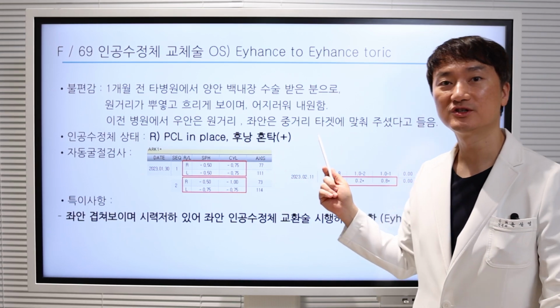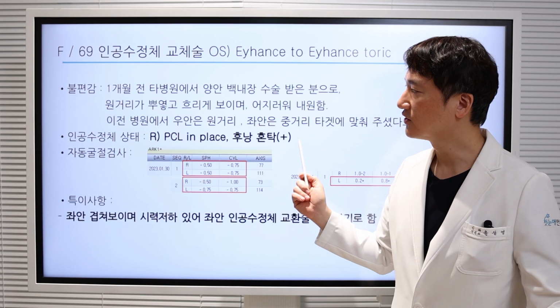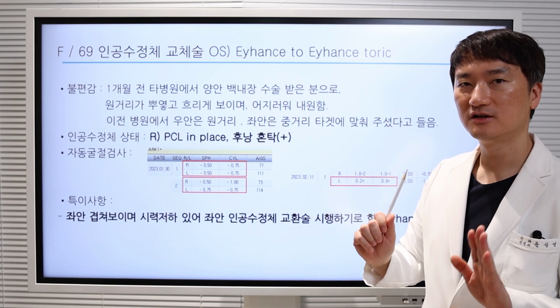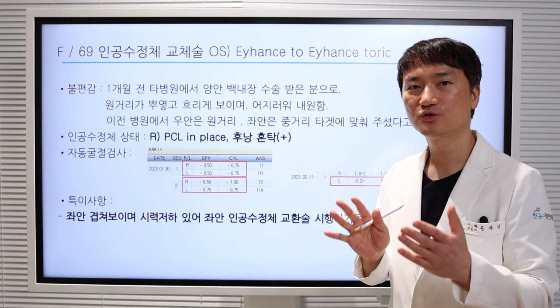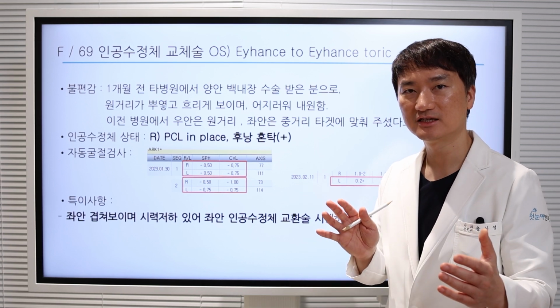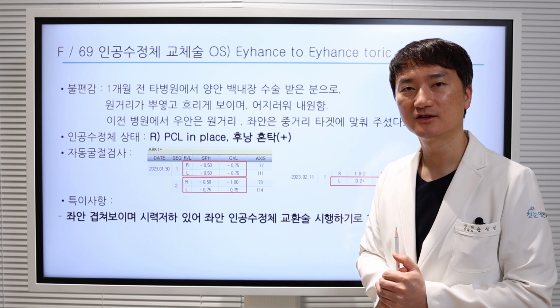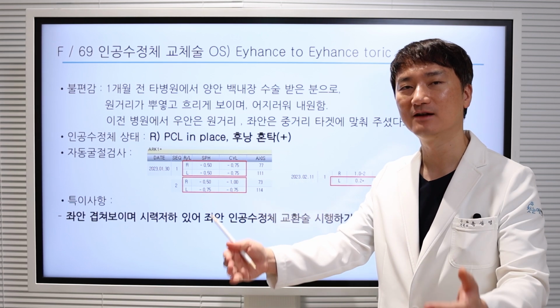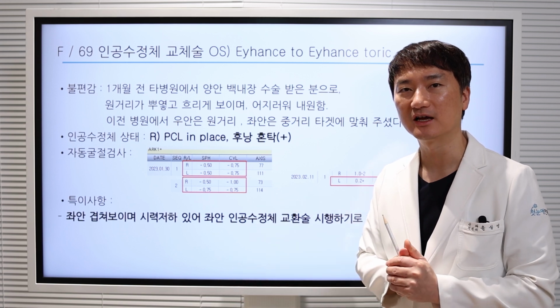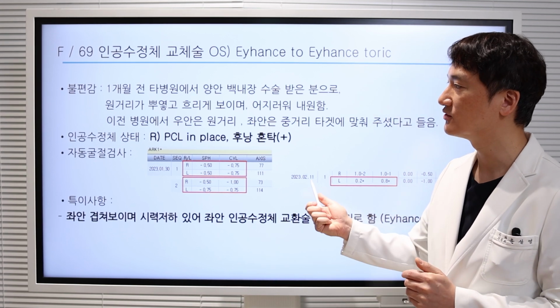They opted for monovision. In these situations, while the Eyhance lens provides a wider focal range, it does not quite reach the effectiveness of a multifocal lens. Therefore, when you adjust the Eyhance lens to achieve clear vision at a distance, it results in a compromise, sacrificing clarity for near vision. This approach was chosen to balance these differing visual needs effectively.